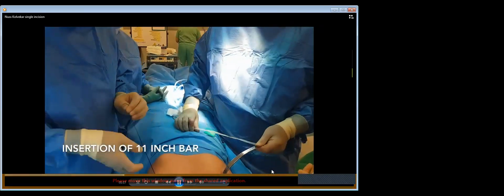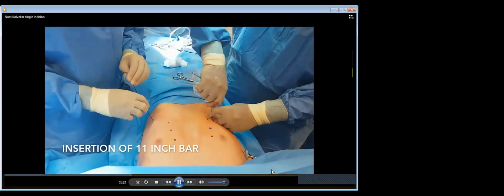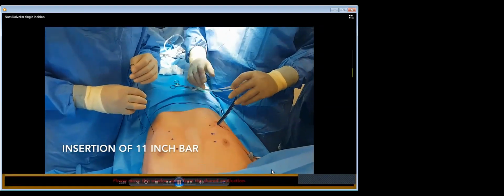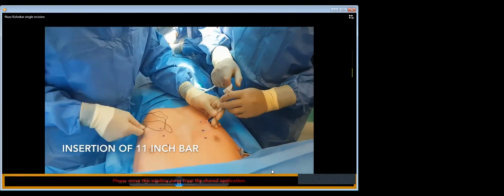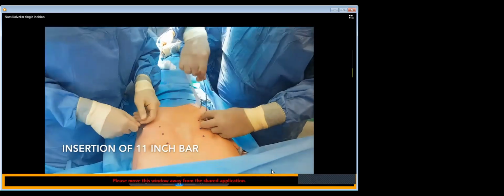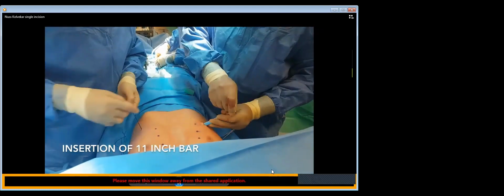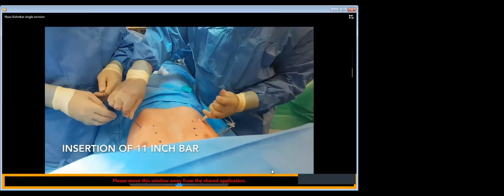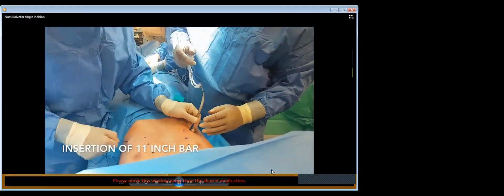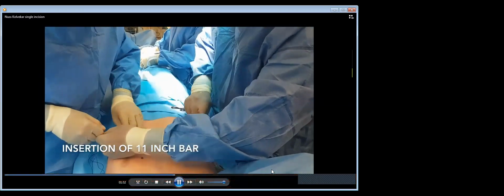And then we watch through the telescope underneath. And once it goes in, it goes across. And we pull it on the other side. It looks pretty brutal, this whole procedure. My anesthetist for 20 years usually closes her eyes at this time because it looks quite barbaric. But the results are fantastic. If you've done it nicely, the results are very good. You have to use a certain force so that they go across.